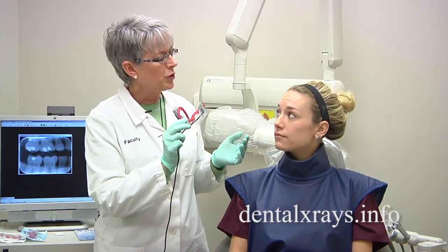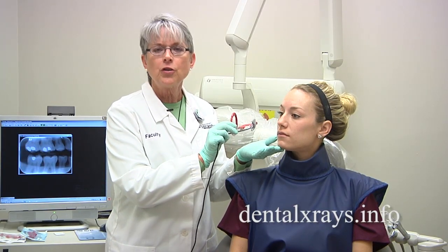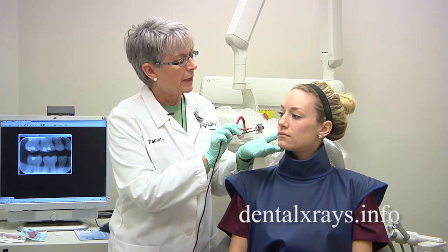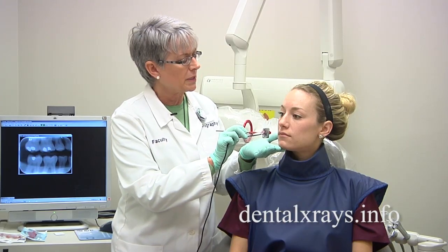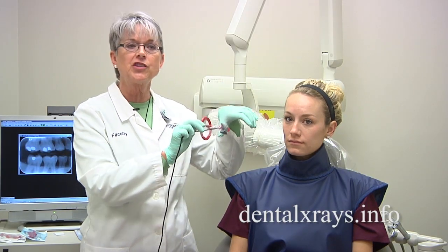What happens is that when you try to put the sensor close to the patient's tooth, you're not going to be able to get a good view. It's not going to be close enough. You're going to have to move it toward the middle of the patient's mouth where the arch is higher.